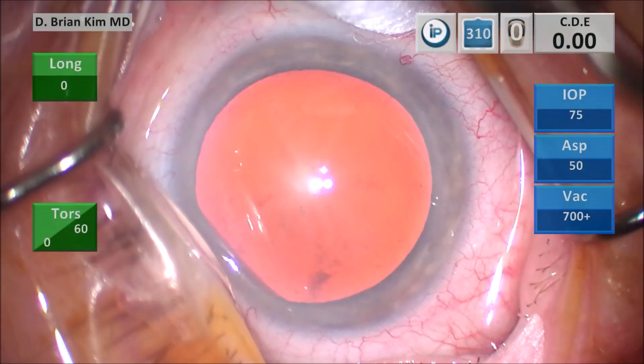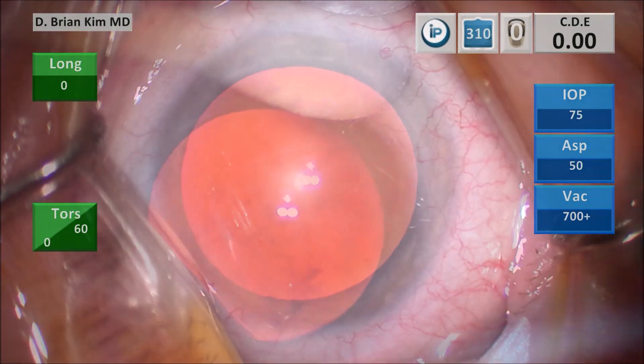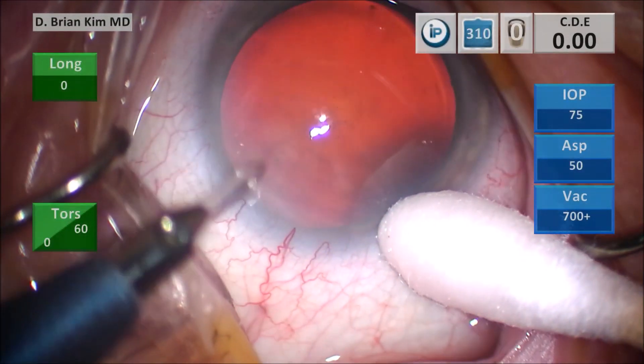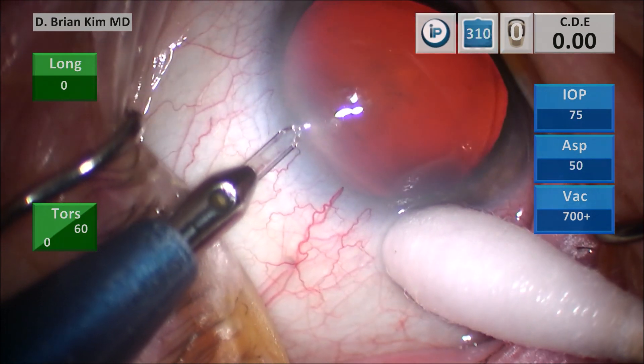I'm going to use a cotton tip to make the eye straight and then I'm using a corneal marker which will help me to center and size my rhexis. I'm using a cotton tip to turn the eye and then I'm making my paracentesis incision parallel to the iris plane. This ensures a nice self-sealing corneal incision.